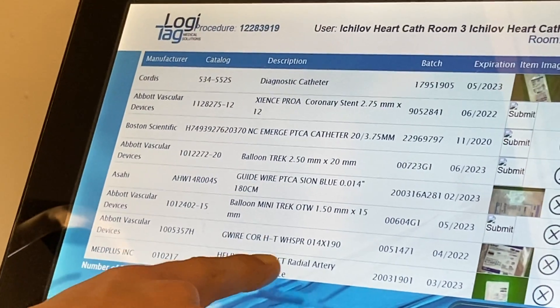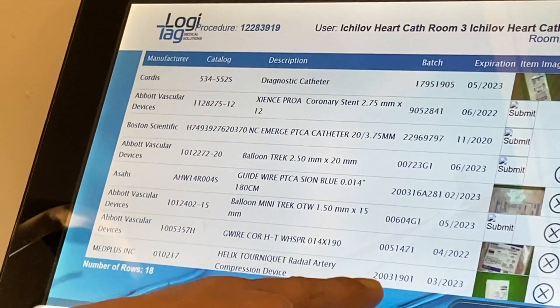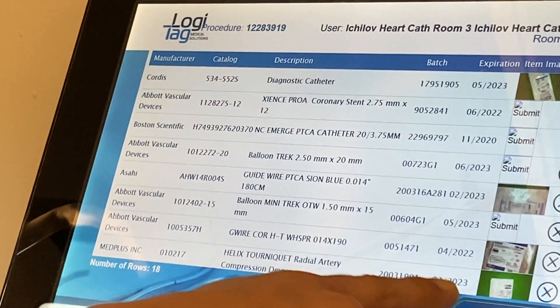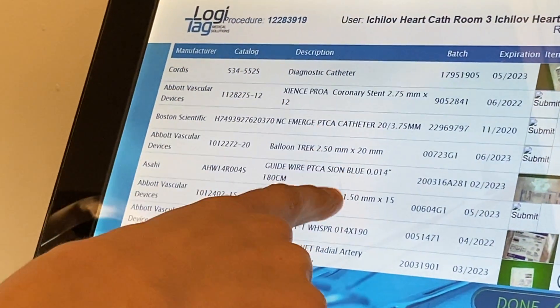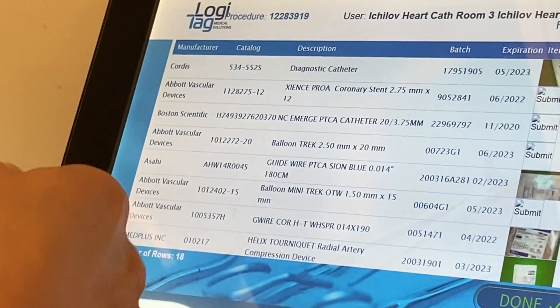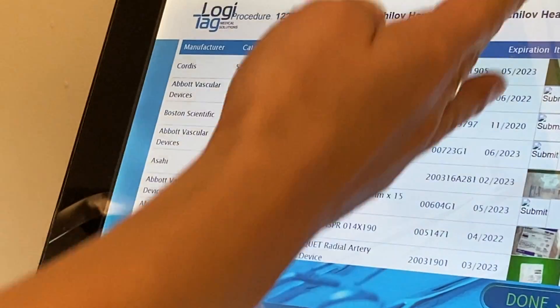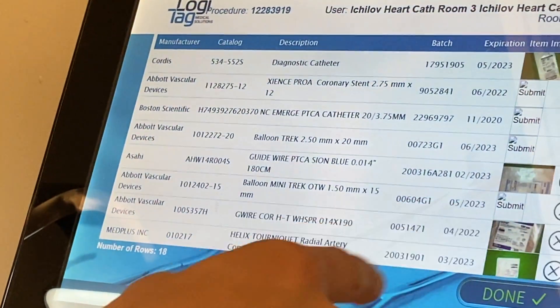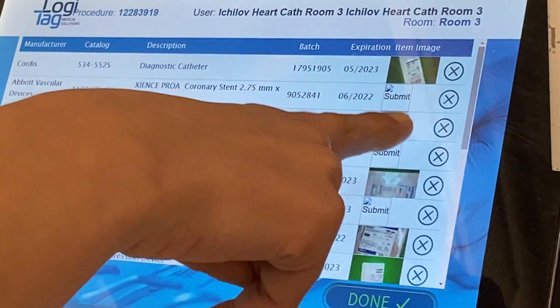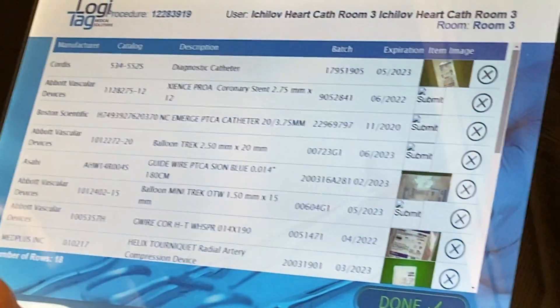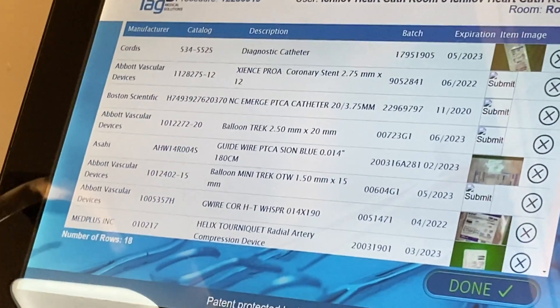Your description, your batch, and your expiration date — it's all very important information. And of course you have your image. Where there isn't an image, that's where we have the RFID scan.